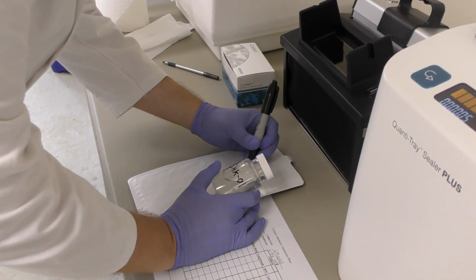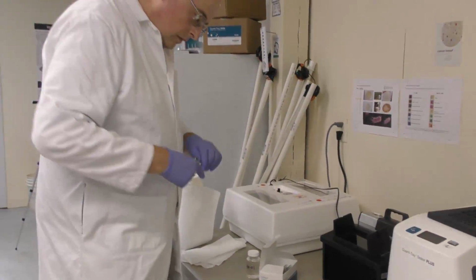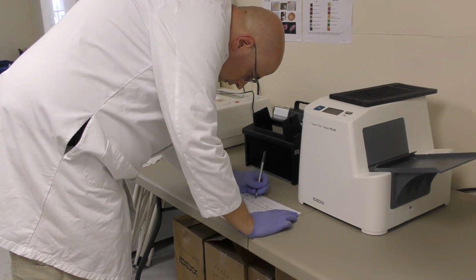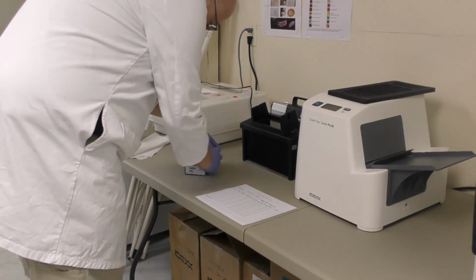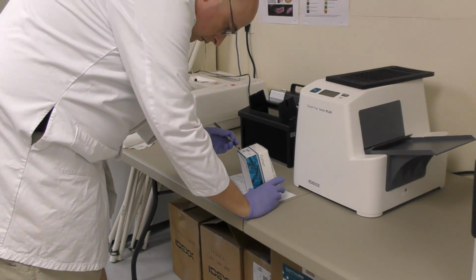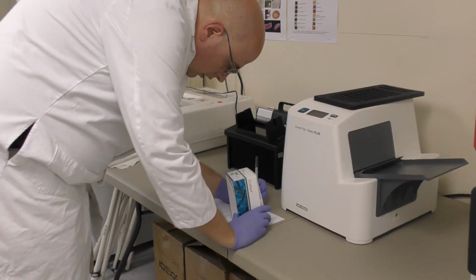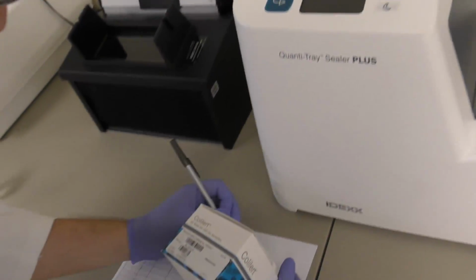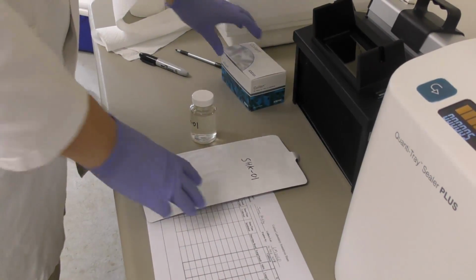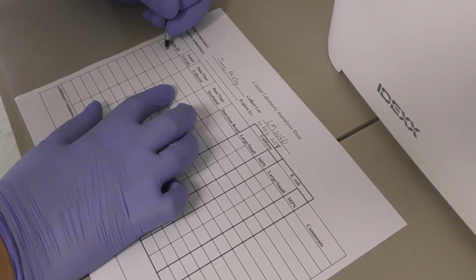label the quantity trays. Now the technician is going to be recording some information on their laboratory sheet. The sheet that was submitted by the volunteers is the field sheet, but there will most likely be a secondary sheet for the technician to process lab specific numbers. One of the things that the technician is going to record is the lot number and the expiration date that's printed on the end of this box of the Colilert on their log sheet. They're going to record the samples that are going to be processed during this run, and the volumes that are going to be tested. Generally it's going to be 100 milliliters, and the date and time that those samples were collected, so they're going to record that off of the field sheet.